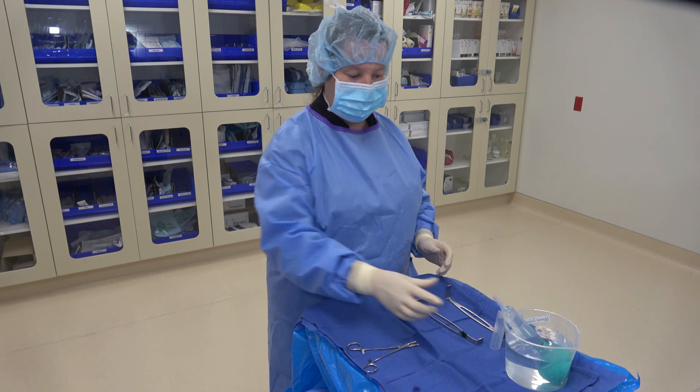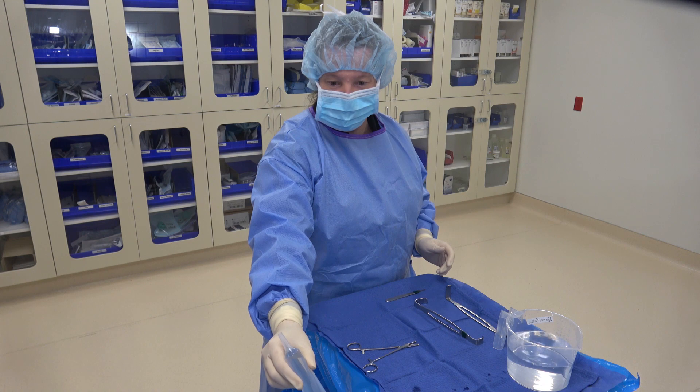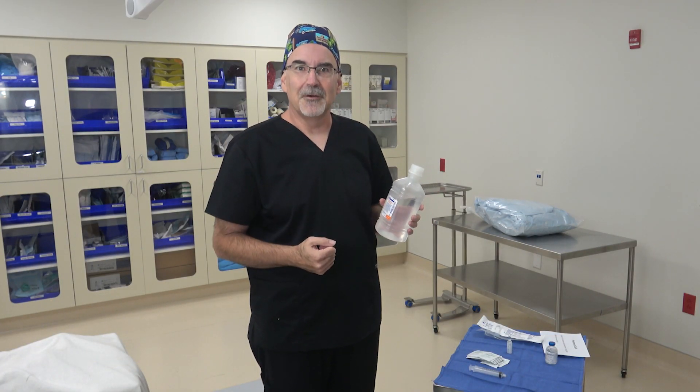Whenever you pass your irrigation to the doctor, you will always state what it is: '0.9% saline.' So that's how we transfer irrigation onto our sterile fields.